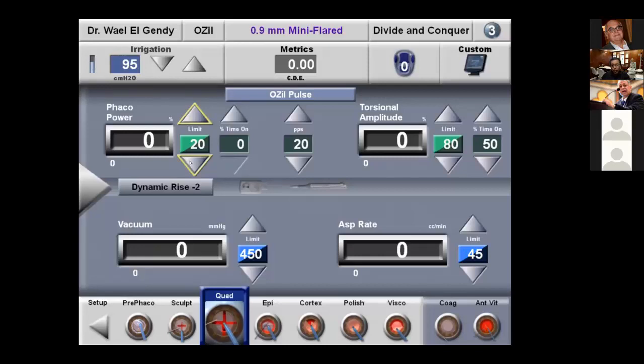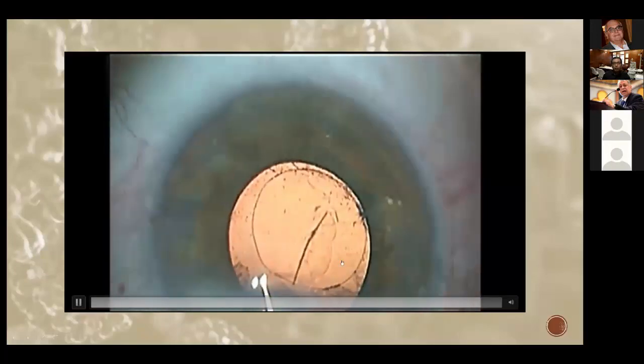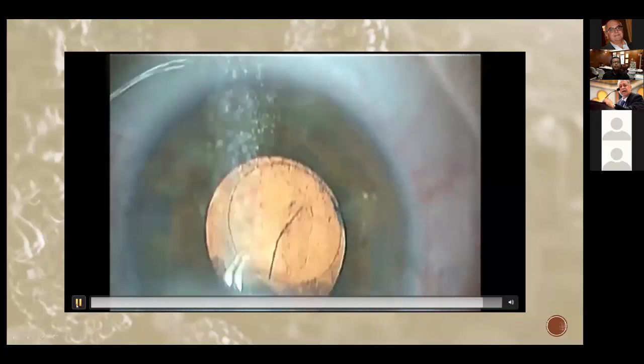If I'm afraid that I'm going to entangle the posterior capsule in the tip, like what happened with me, I will not use torsional, because torsional phaco shreds the posterior capsule once it holds it. So I will go with longitudinal phaco because it's more forgiving. It doesn't mean that longitudinal phaco will not rupture your posterior capsule if you continue emulsifying. But if I got entangled like this time with torsional phaco, I have a higher liability to get posterior capsular rupture. And that concludes this surgery.